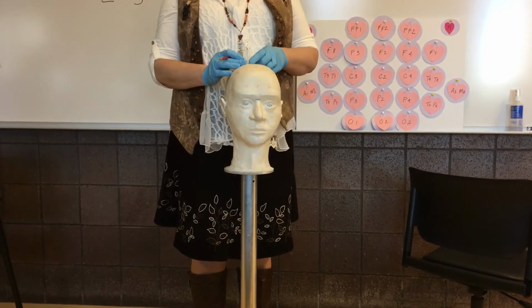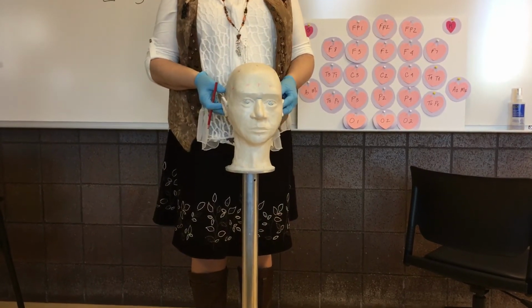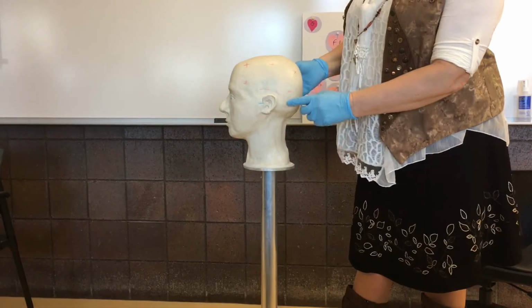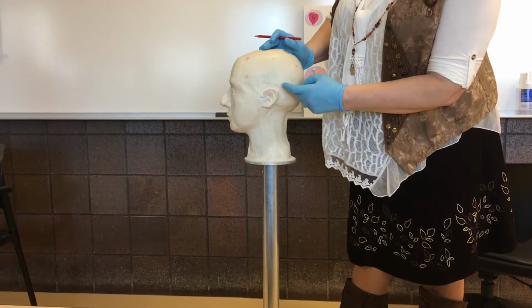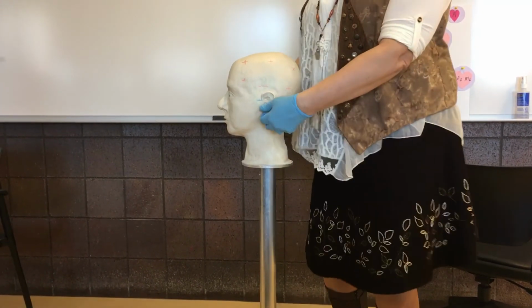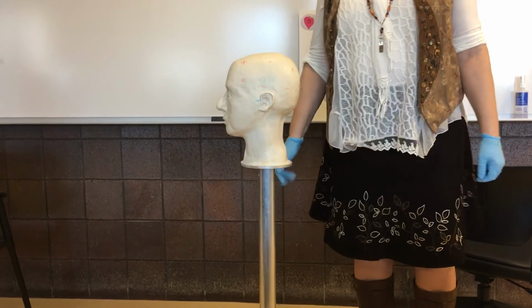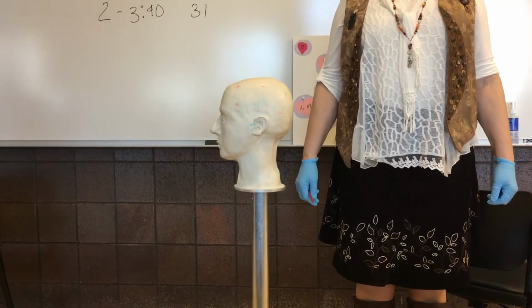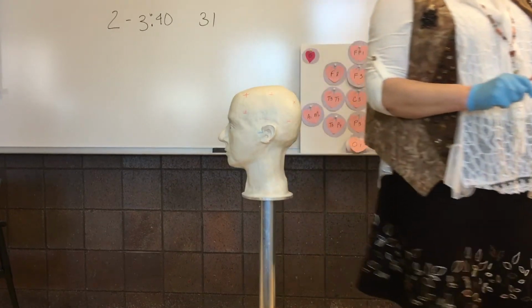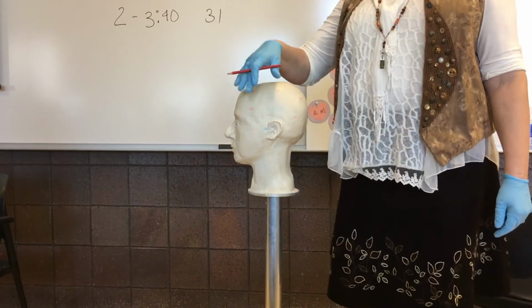Question? So like, what would you do, for instance, if somebody had a cochlear implant? That would be behind the ear, usually back here. You wouldn't put an electrode on the mastoid then. You could maybe move it up and move this one up and document. You could use the lobe. So in terms of proper documentation, we could just make a note, cochlear implant, whatever it is, shifted this up. How many centimeters, millimeters? How many, 5 millimeters? The least amount of millimeters you need to move it to not get in that sterile field.